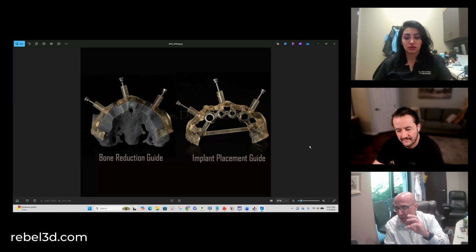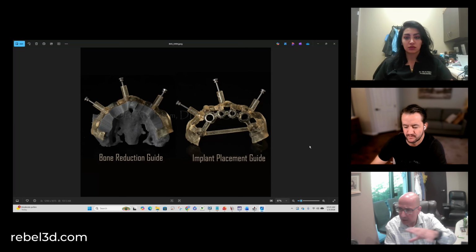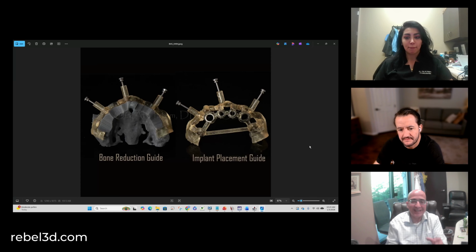Matter of fact, patients come here, we do the pre-op, we design it. Dr. Ola finishes her design with the patient. We discuss first together what we need to do. And for me, sitting just 10 or 15 minutes, capturing all this data and making my surgical plan, and I'm done. No cost, nothing. I can be finishing my surgical plan 10 minutes before the surgery, and I'm fine.